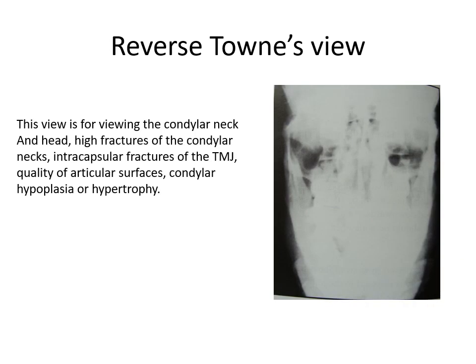Next, the indications of the reverse Towne's view. This view is for viewing the condylar neck, condylar head, high fractures of the condyle, intracapsular fractures of the TMJ, the quality of the articular surfaces, and condylar hypoplasia or hypertrophy.